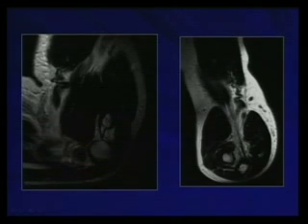This is an MRI of the elbow performing FABS position, that is flexion, abduction, and supination. That is the position that we use to check for distal biceps tendon tears. And you can see here the brachialis with the normal attachment at the ulna. This is the biceps tendon, and this is the biceps muscle, and this is the wavy appearance of the biceps tendon.